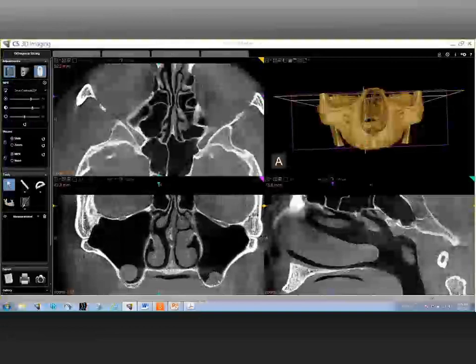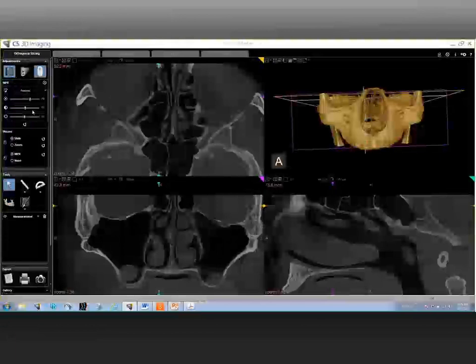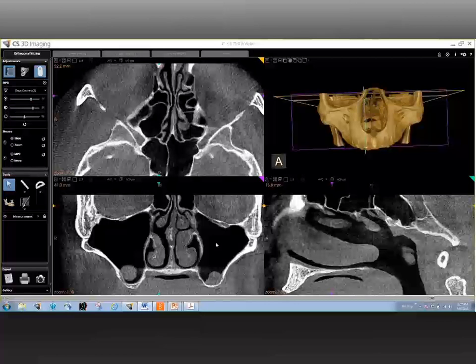When you see something like that, it is important to take a consultation with concerned parties, let the patients know about it, and take a consultation from experts in that area. Now, if I recall from past conversations, soft tissue anatomy is not able to be visualized with CBCT. So why are we able to see the soft tissue you just pointed out in the sinus? Good memory, Jordan — that is an excellent point. Yes, soft tissue contrast cannot be identified with any CBCT unit. But in this case, you're able to see soft tissue contrast within the sinus because the sinus generally has to be black — it is nothing but air. In that background, there is enough contrast for the soft tissue pathology to show up, and that is the only reason you are able to see sinus pathology.